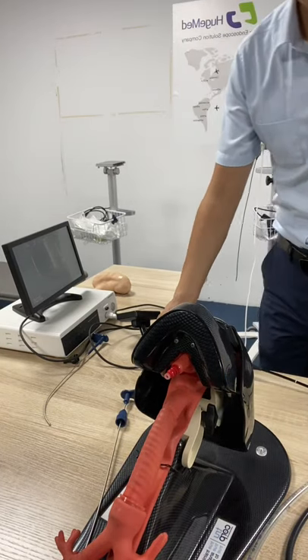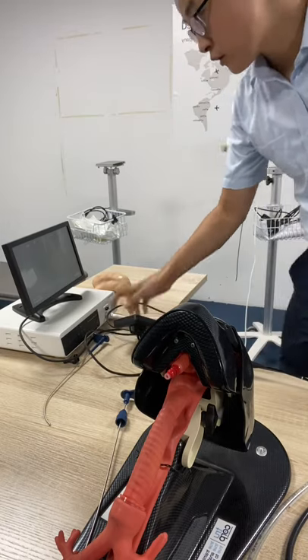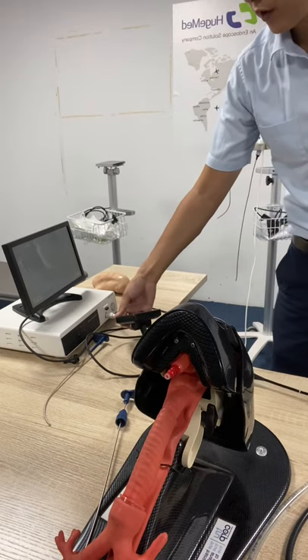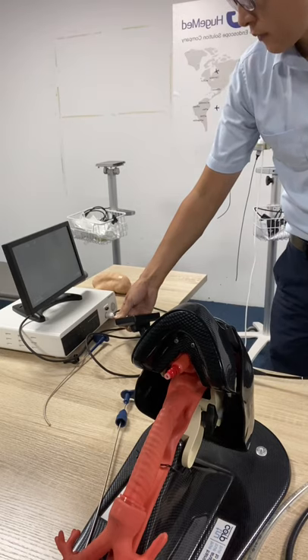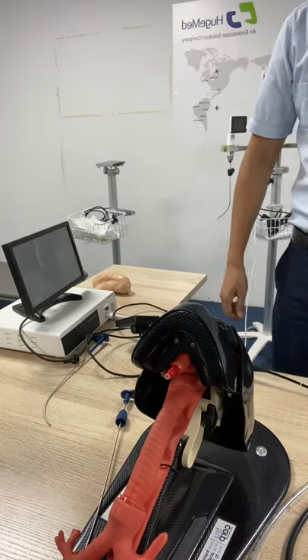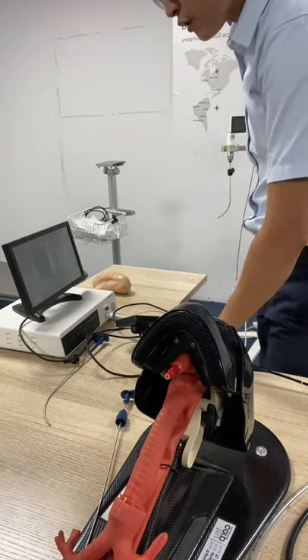The operation is the same. First, check the monitor — this one is white balance. Before operating, we need to do the white balance. Long press the white balance key until you see it shows AWB. AWB white balance is finished.